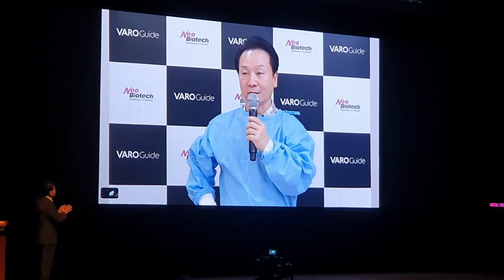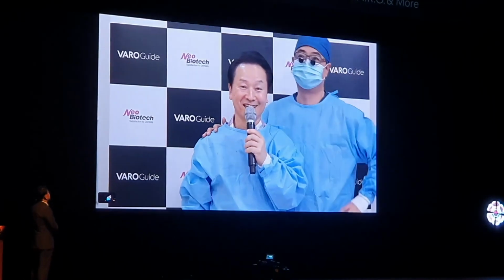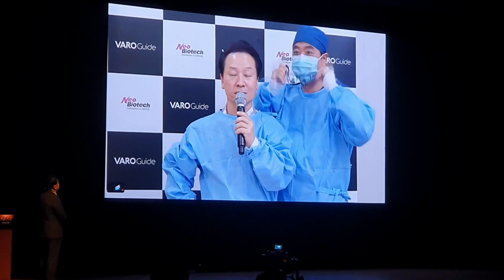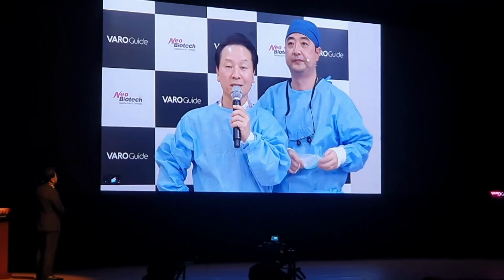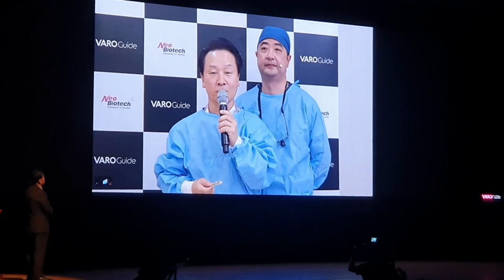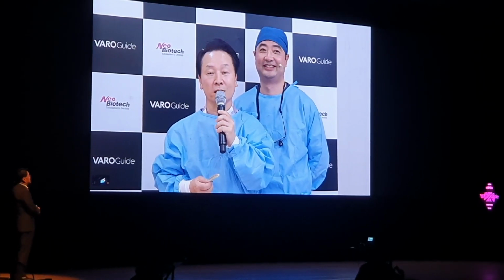So I have a question. As a patient, how did you feel about using the VARO guide? Tell us about your experience. Well, as a doctor, everything went so easily, but really my own bone, that was quite a new feeling. And seeing a lot of my own blood made me a little bit nervous. But because of the VARO guide, I could successfully place the implant with great accuracy. I was sort of looking forward to Dr. Kim performing surgery on me, but that didn't happen. Anyways, I'm very happy that it turned out very well.